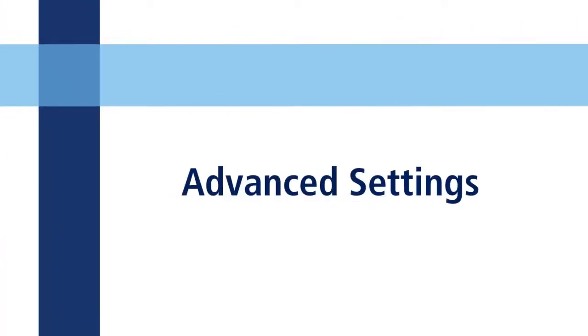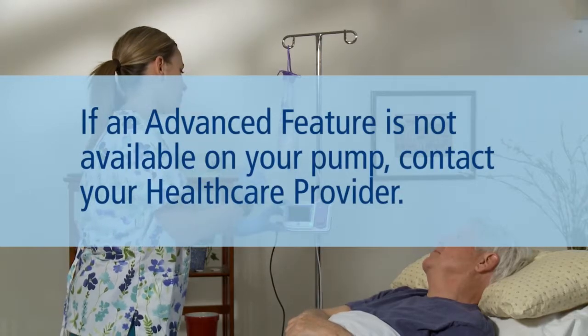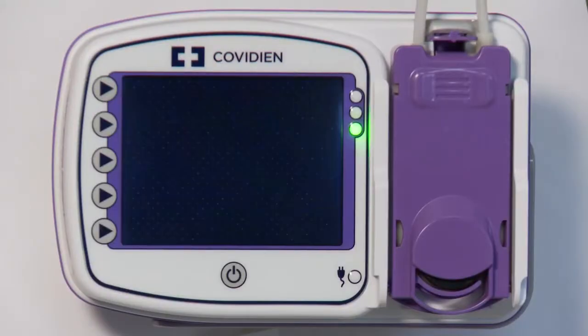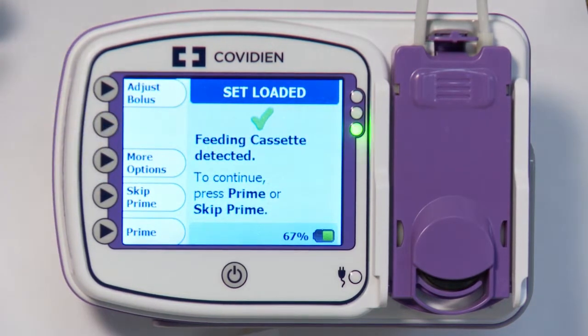Advanced Settings. Each time you power on the pump, you will select Keep or Clear Settings. If you have already primed the set, select Skip Prime when prompted.